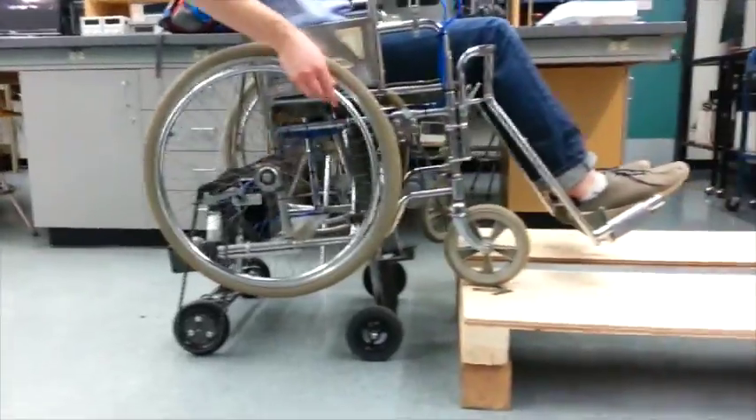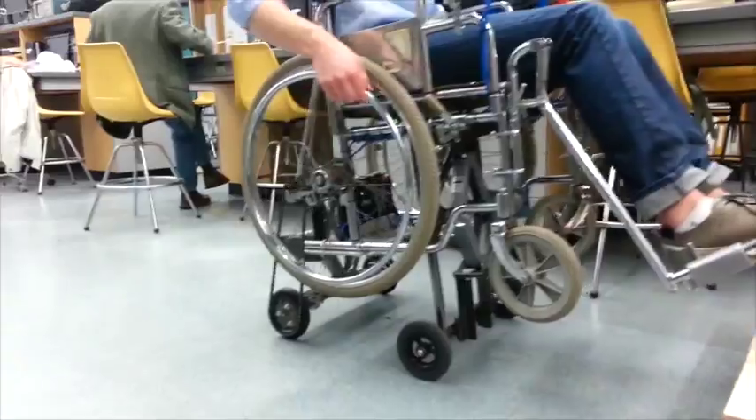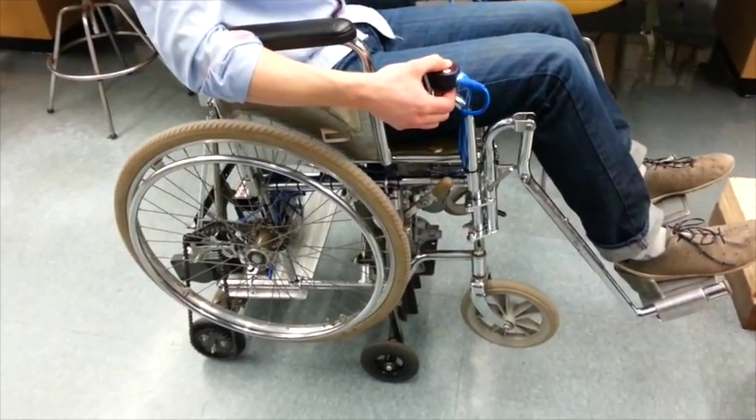Remove the brake once again and drive the wheelchair back until the footrests are clear of the curb. Hold both down switches simultaneously until both axles are fully retracted.